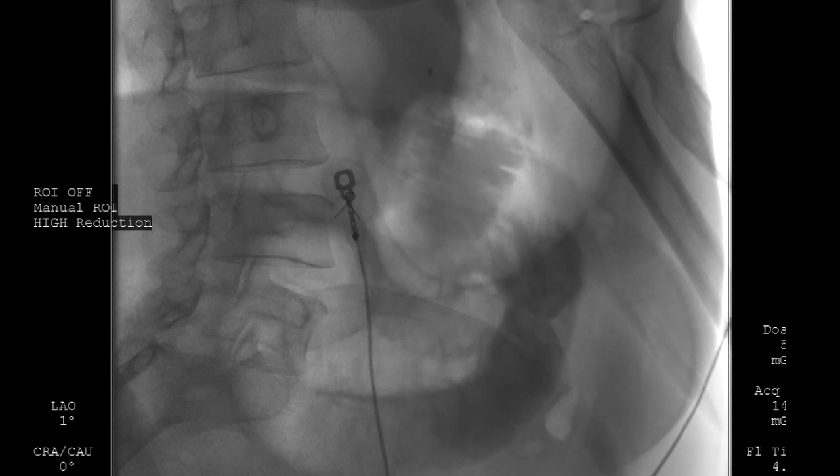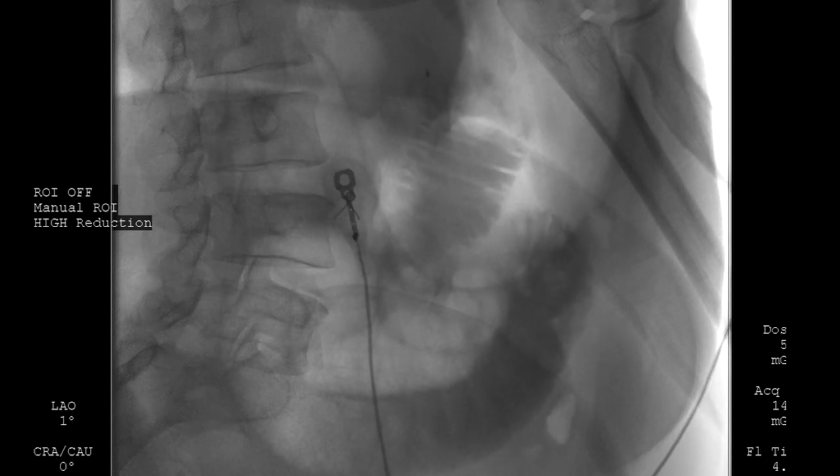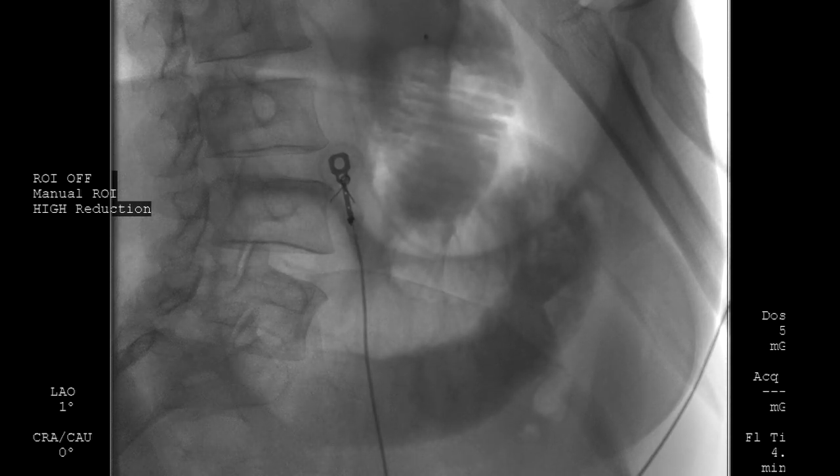Then, a large volume of normal saline mixed with methylene blue and iodine contrast was instilled into the jejunum through the tandem catheter to insufflate the small bowel loop as much as possible.